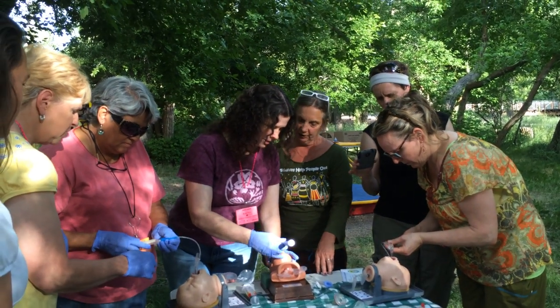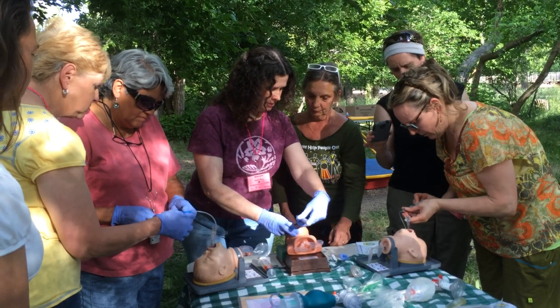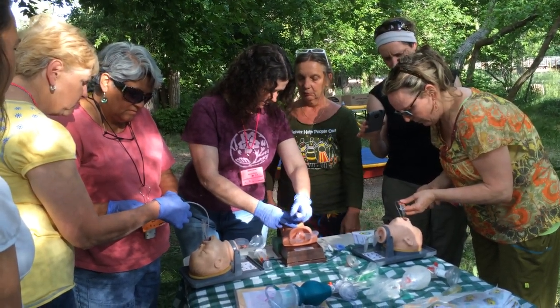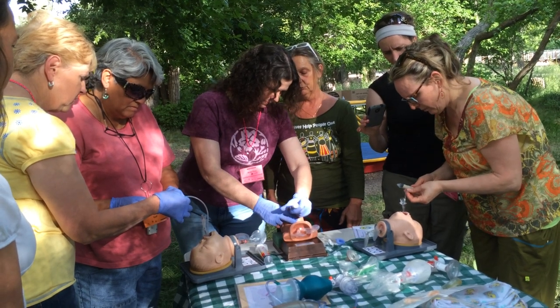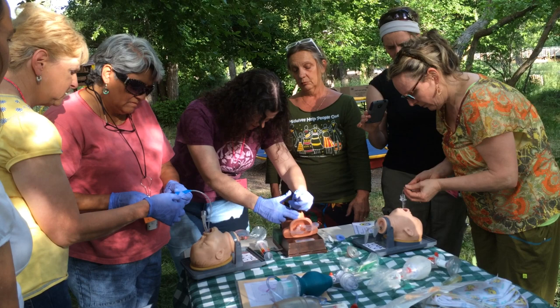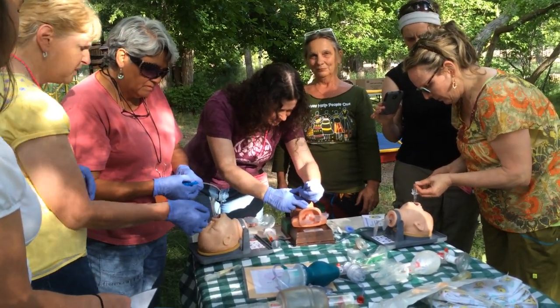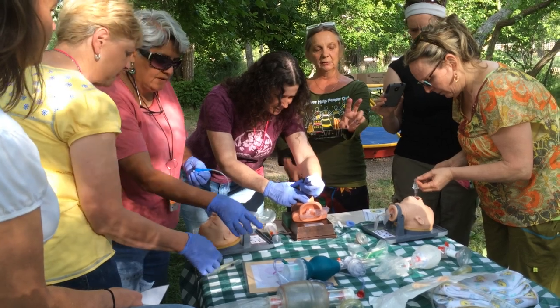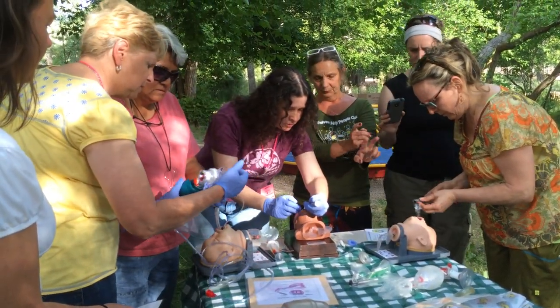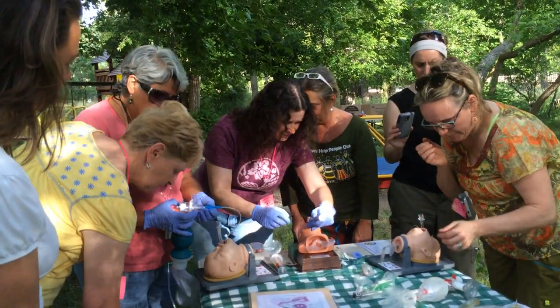Are you right or left-handed? I'm right-handed. So you want to use your other hand, the non-dominant hand. And you don't want to force it down too far. Two little white lines and a black hole in between. You don't want to leverage up the jaw or the roof of the mouth. Oh, you're not supposed to do that? No. You don't use it like a shoehorn.